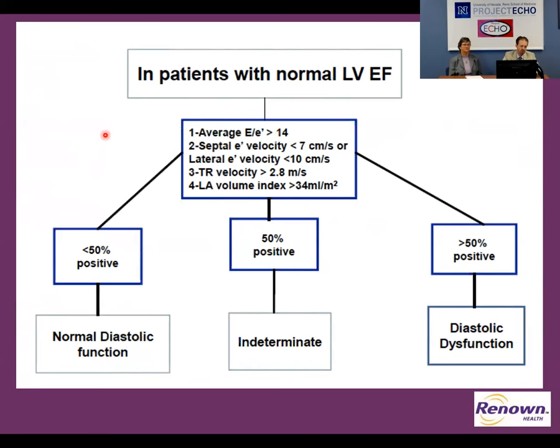And the reason why we've cut back and called much less diastolic dysfunction by our guidelines is because there's a tendency to use those echocardiographic findings as a surrogate for an overall clinical decision, exactly in this case of a person who's a smoker and also probably does have some heart failure with preserved ejection fraction, to use that as a surrogate for the diagnosis of heart failure, which of course it's not. You have to use your clinical judgment in that case.